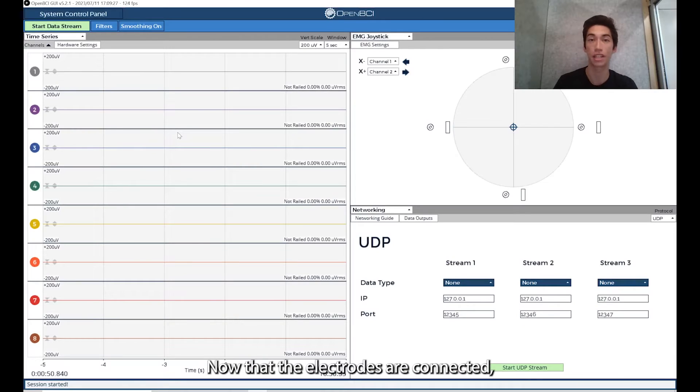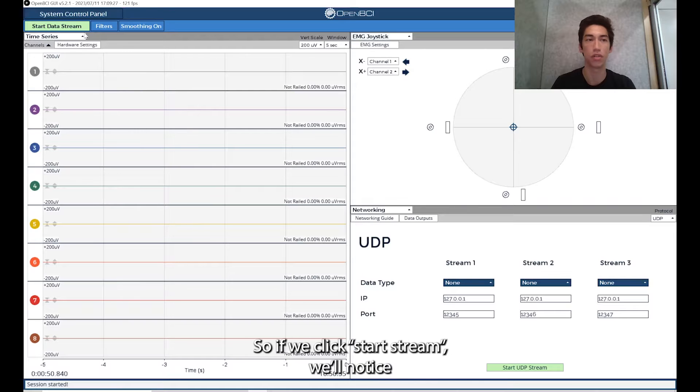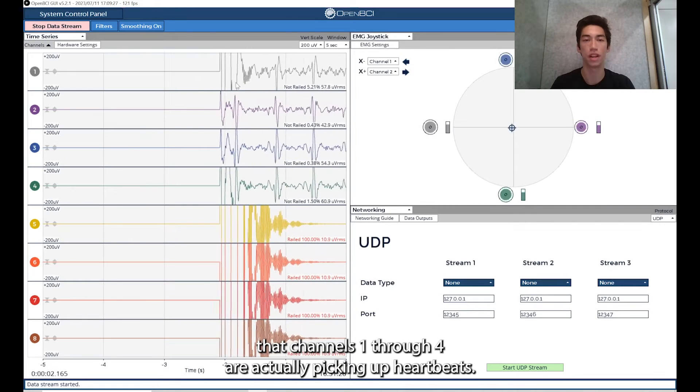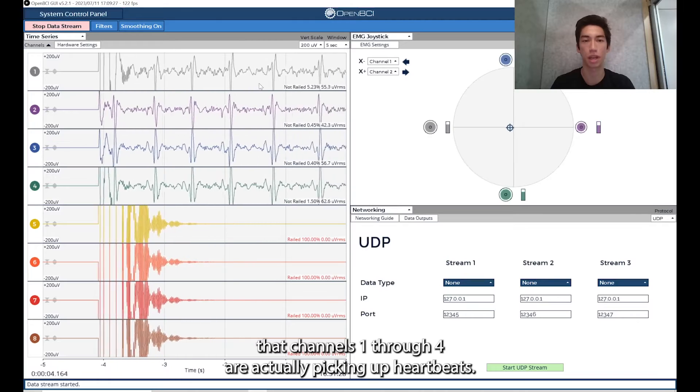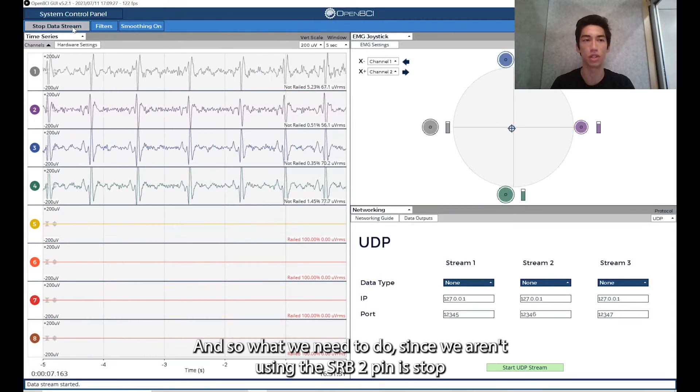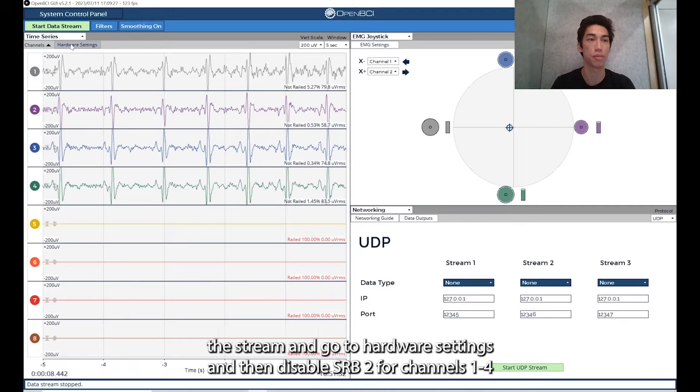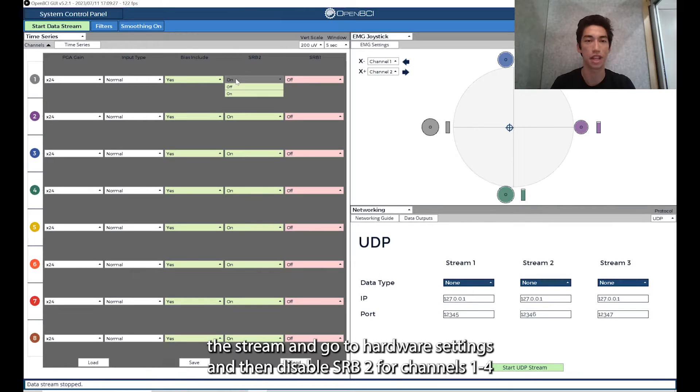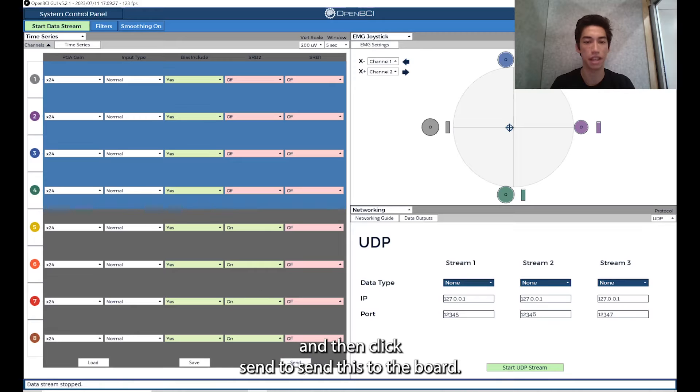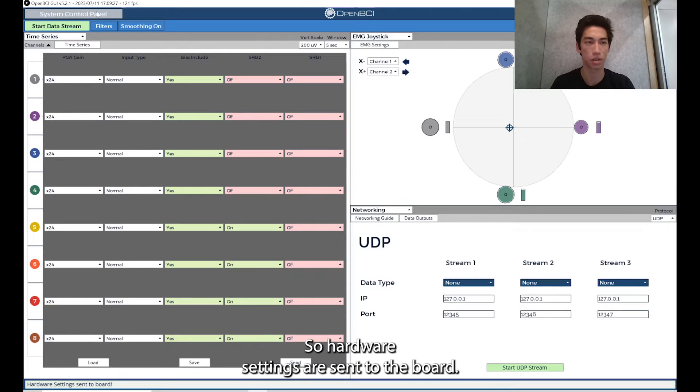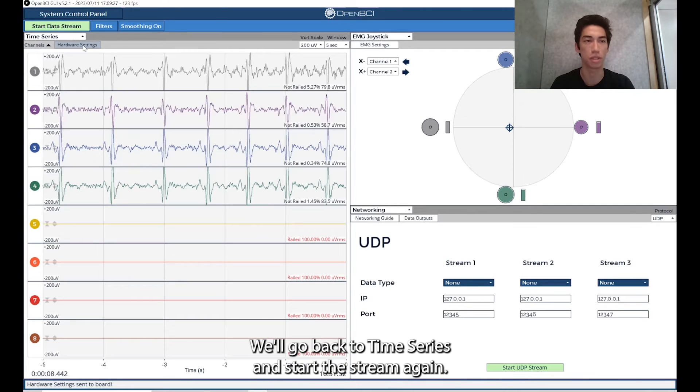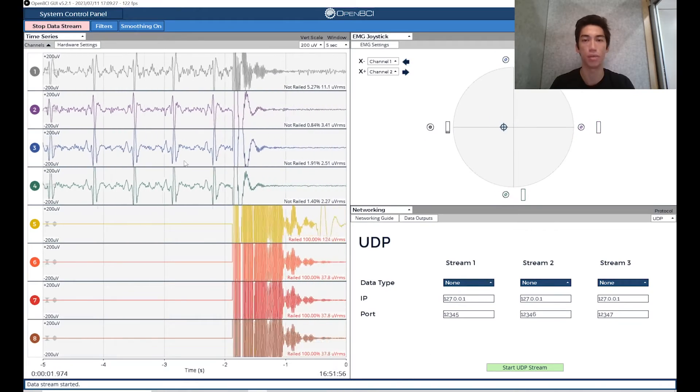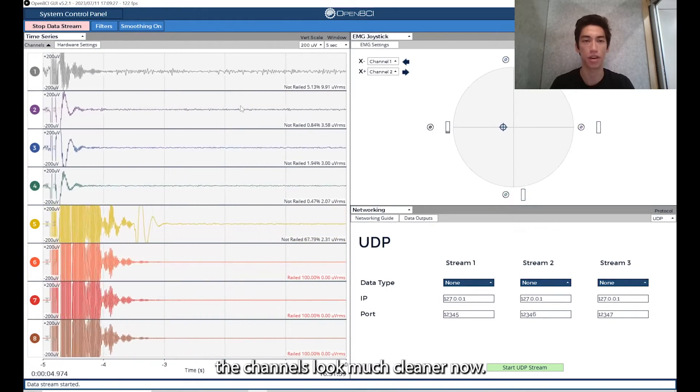Now that the electrodes are connected, we can come back to the GUI and see how the data looks. If we click start stream, we'll notice that channels one through four are actually picking up heartbeats. Since we aren't using the SRB2 pin, stop the stream and go to hardware settings and then disable SRB2 for channels one through four. Then click send to send this to the board. Hardware settings were sent to the board. We'll go back to time series and start the stream again. You'll notice that the channels look much cleaner now.